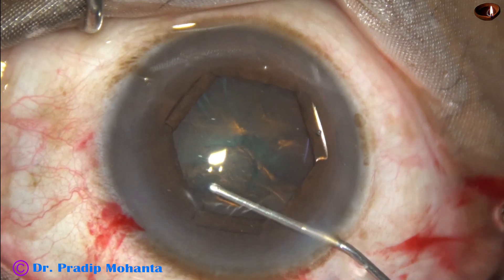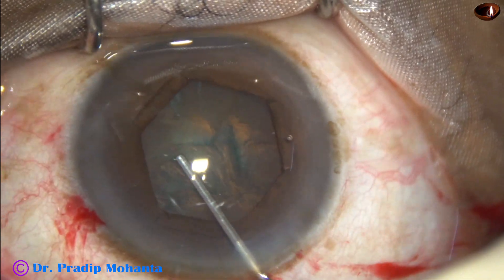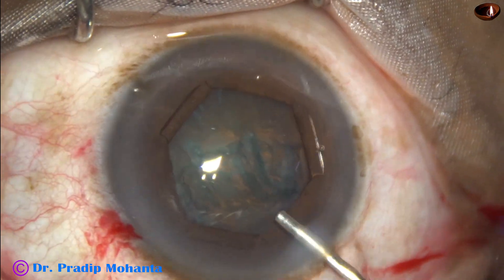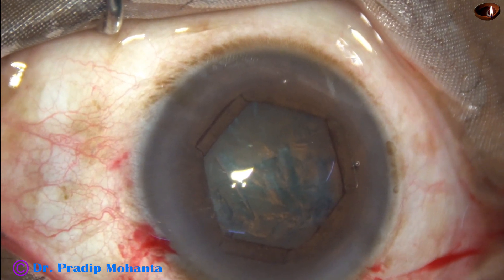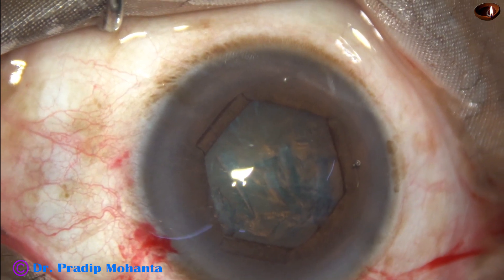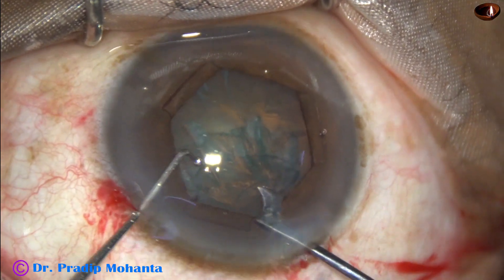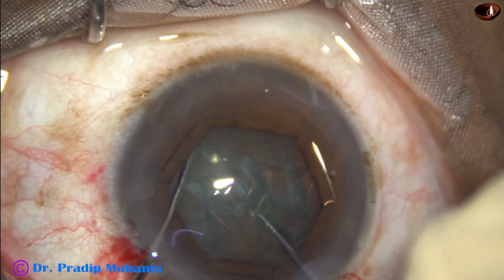Hydrodissection is done using a 27-gauge cannula and BSS, and the nucleus is mobilized. Some more visco is added, and now a pre-chopper is being used for division of the nucleus into fragments. Here goes Dr. Suhail Khan's pre-chopper.